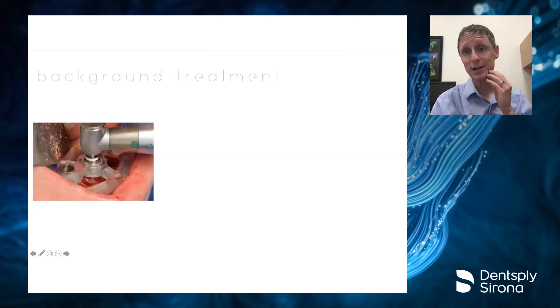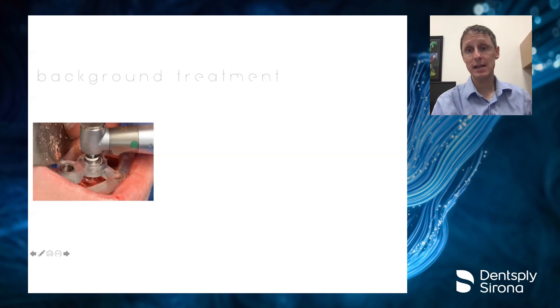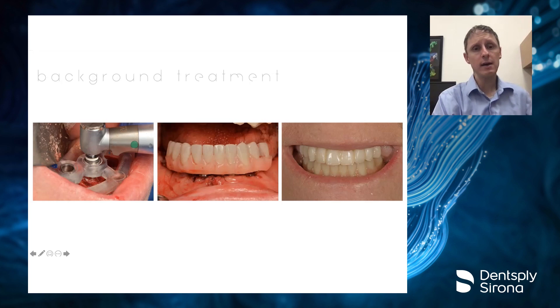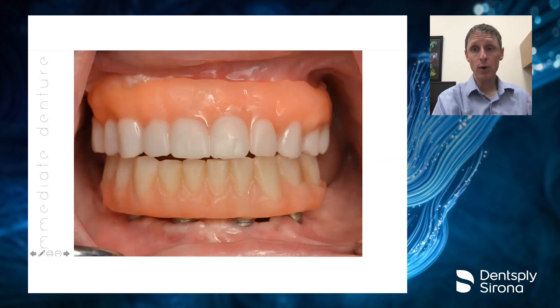We started by taking out the lower arch, put on the implant guide, and used the Astratech EV guided system to place implants. From there, we put on the smart fix abutments and did a conversion prosthesis. On the upper arch, we kept four teeth not in the way of implant placement, took out all others, and put her in a printed provisional on those four teeth while bone grafting everything else. After a few months it was noted we needed more bone, so we took out those remaining four teeth, grafted again, and placed her in an immediate printed denture. Now the lower arch is fully healed and we're ready for definitive restorations.